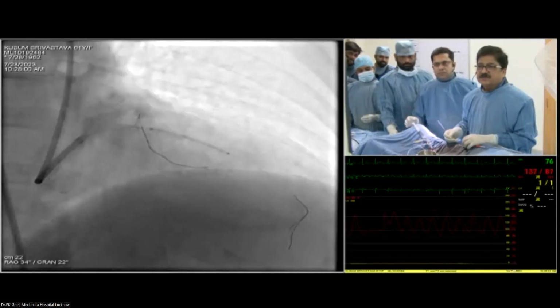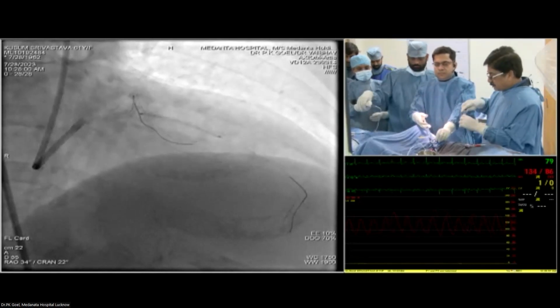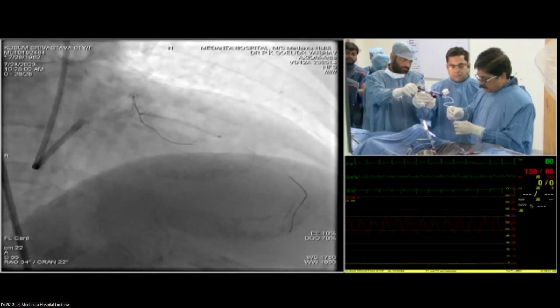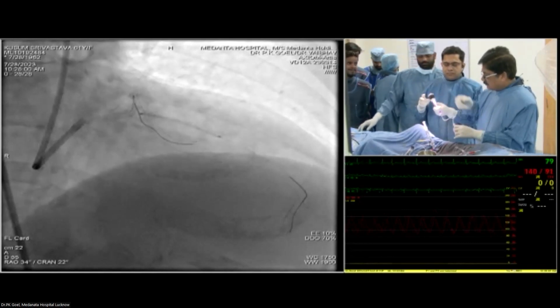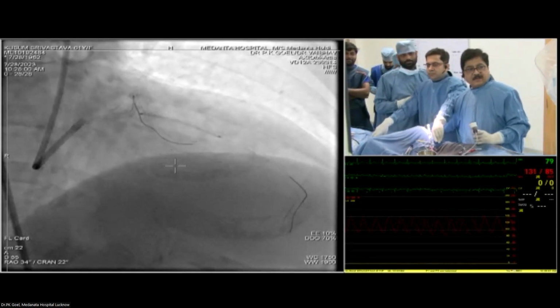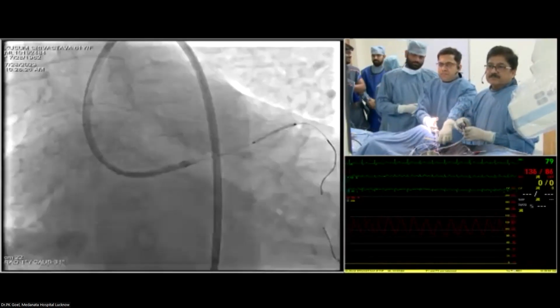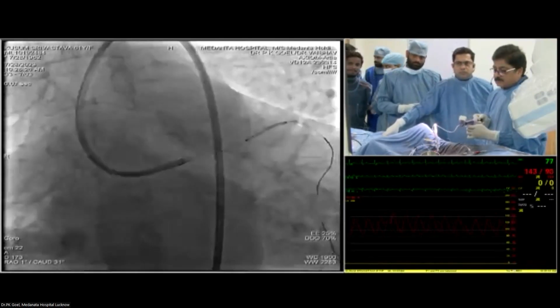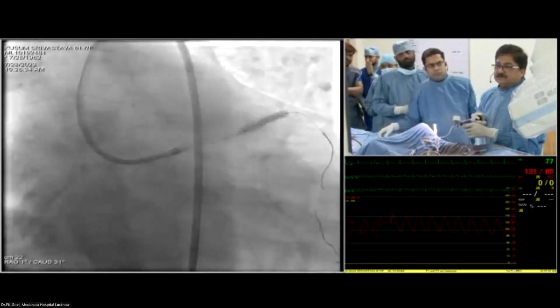Ramesh, yes, don't you, Sunil, think this was a clear-cut case for two stent and mini crush? In my practice, I would deal with this as a simple bifurcation lesion as defined by the definition study and would do provisional stent, and either prep the side branch with a balloon or a cutting balloon and leave it alone after final kissing balloon. In India, you have at least a drug-eluting balloon. If you are doing two stent, then I would go for the DK crush.